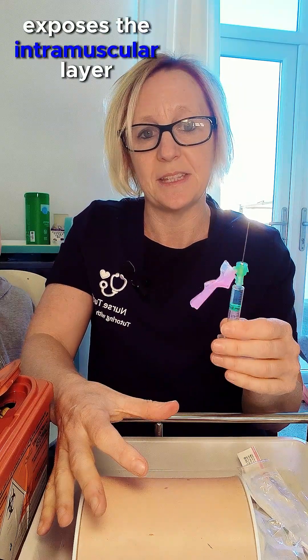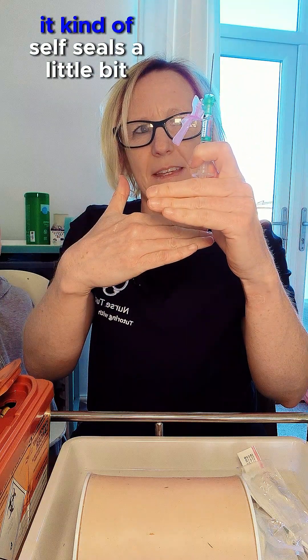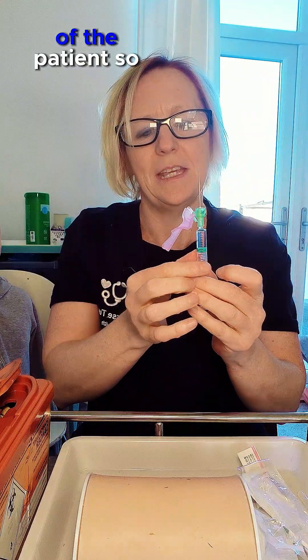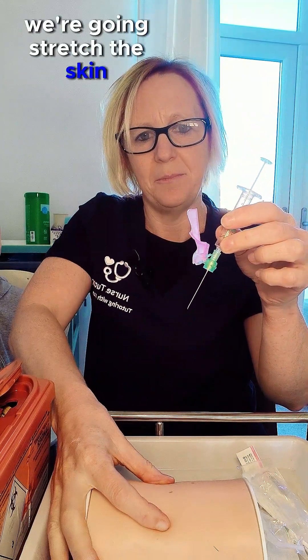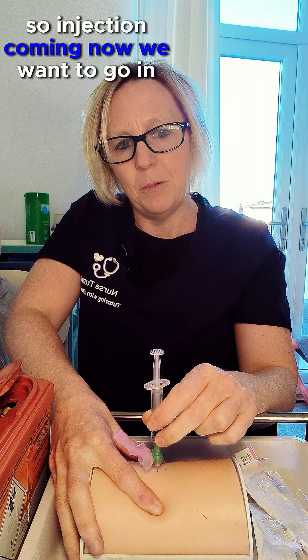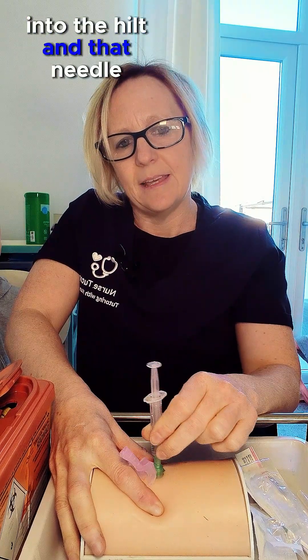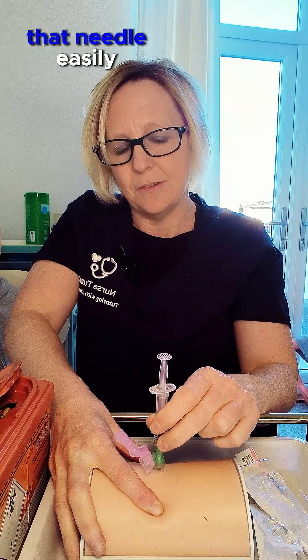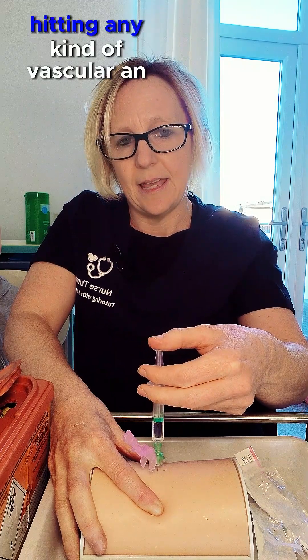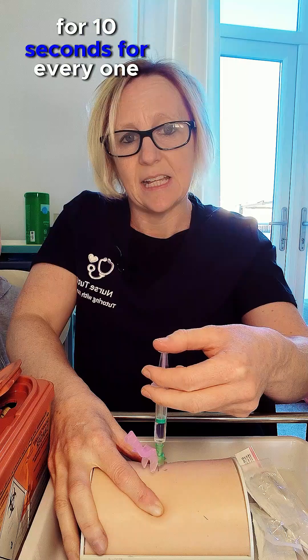Stretching the skin exposes the intramuscular layer and also provides what we call a Z-track — when you take the needle out and release the stretch, it kind of self-seals the injection track site to prevent medication from tracking out of the patient. We hold it between our thumb and forefinger, stretch the skin, and go in at an angle of 90 degrees. We want to leave one centimetre of the needle exposed — if the needle snapped off or the patient moved suddenly, we could still retrieve it. Because we're going in at the deltoid, we don't need to aspirate back for blood, as there's no risk of hitting a vascular artery there. We administer the medication whilst maintaining the stretch for 10 seconds for every one mil.